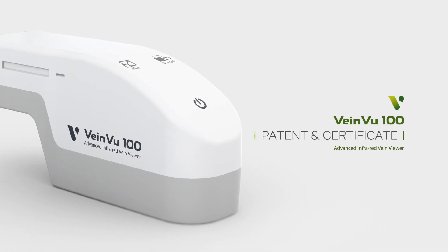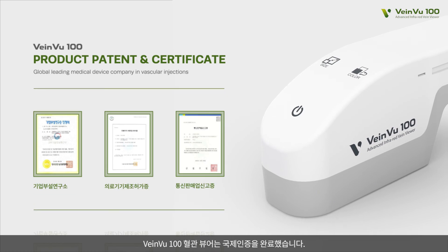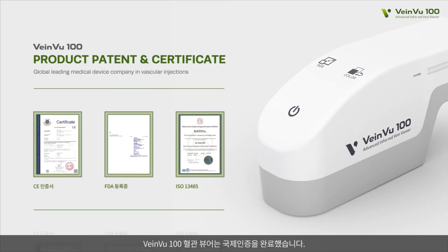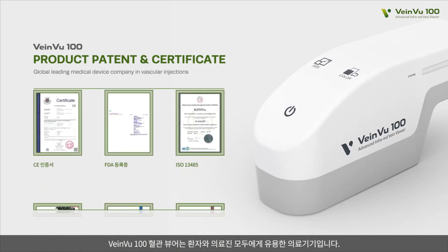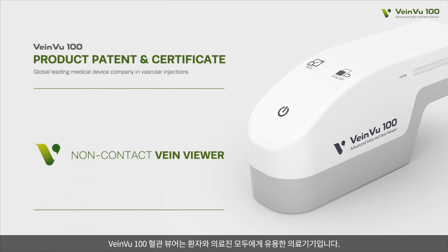Patent and Certificate. VeinView 100 Transilluminator has an international certificate. VeinView 100 Transilluminator is a medical device that benefits both patients and medical staff. Non-Contact VeinViewer, VeinView 100.